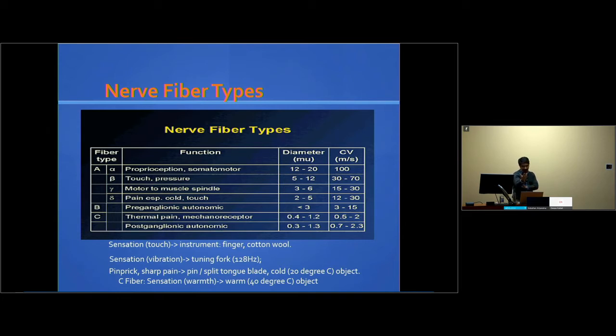And then with pinprick, we look at sharp pain, and for temperature we typically use the tuning fork, assuming that it's colder than 20 degrees. But if you are doing studies, or a formal proper testing, anything that's going to test cold temperature should be 20 degrees or less, and warm would be 40 or more.